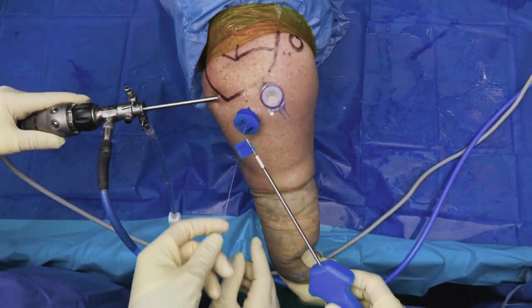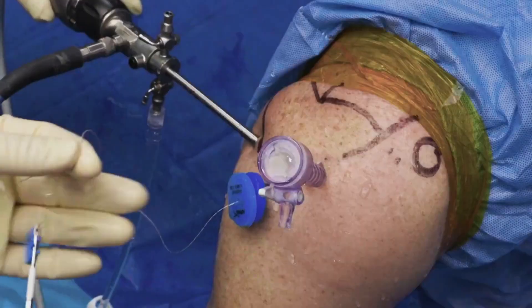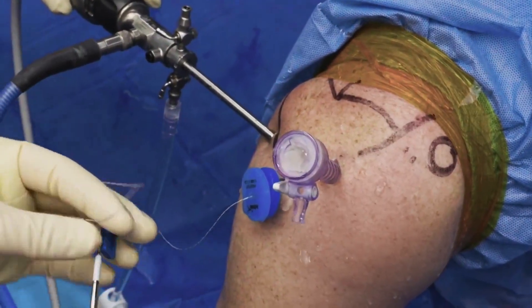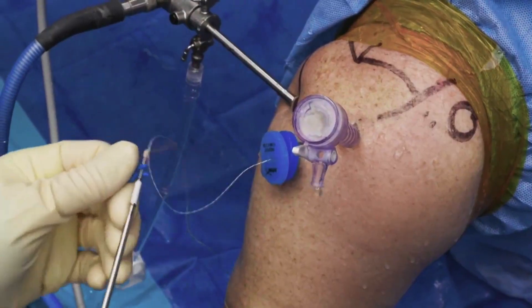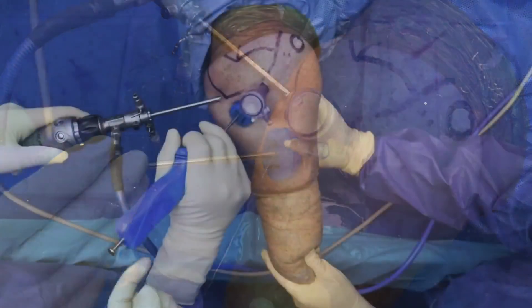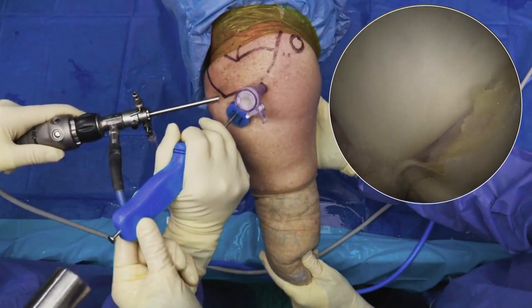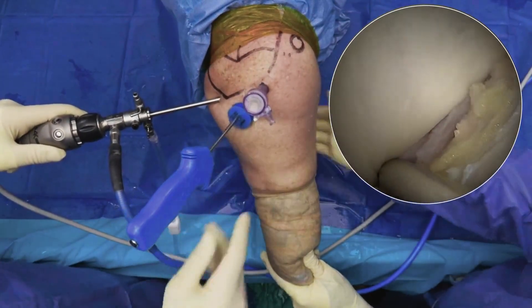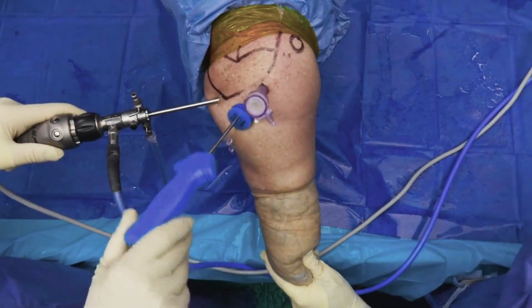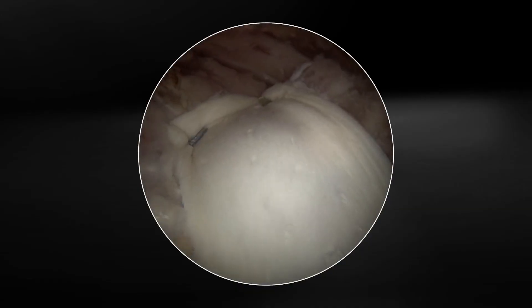The second 3.5-millimeter self-punching push lock anchor with a peak tip is utilized for the posterolateral suture. The graft is properly tensioned over the top of the rotator cuff.